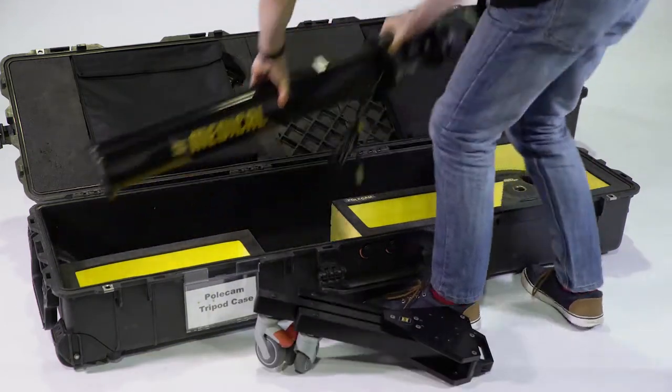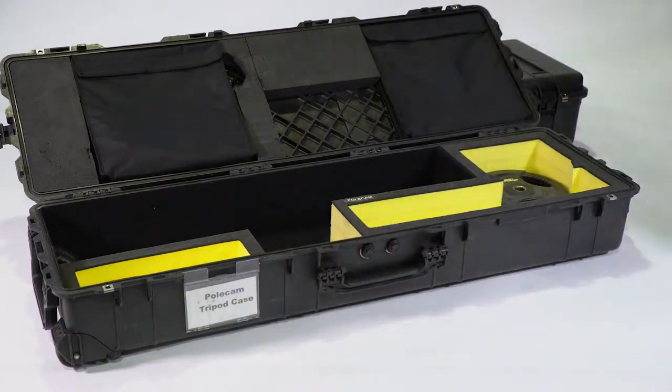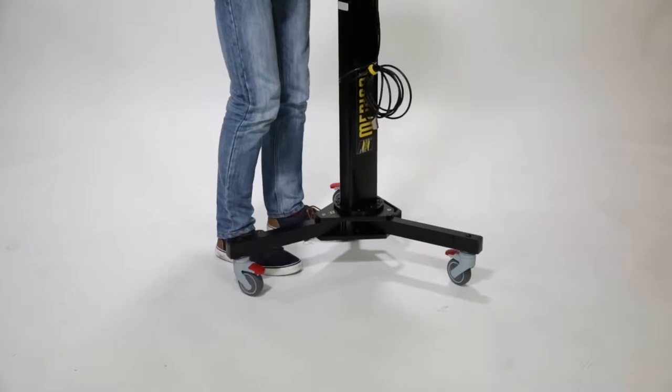Starting with the tripod box, unload the dolly and autopod leg. Mount the autopod onto the dolly and ensure all four screws are fastened securely.